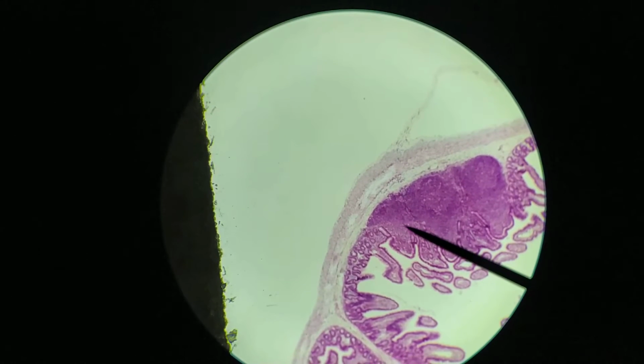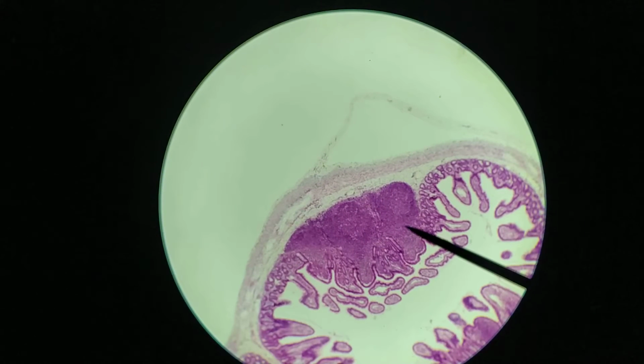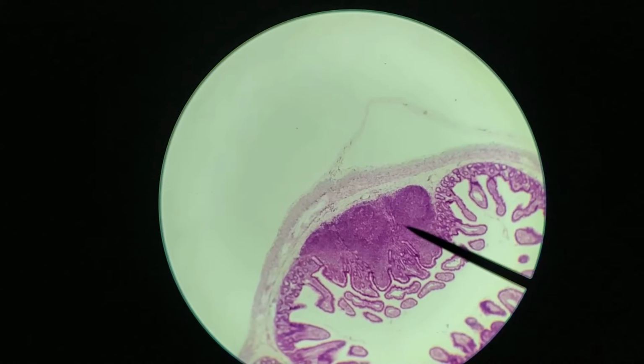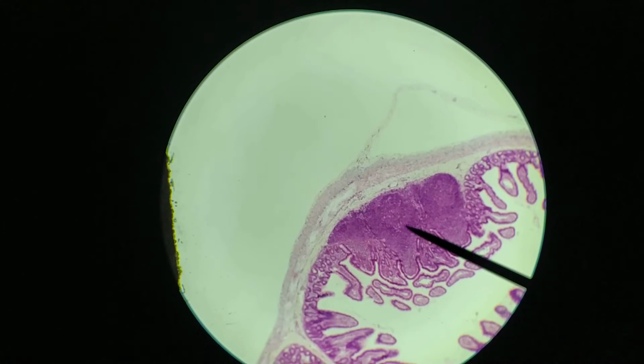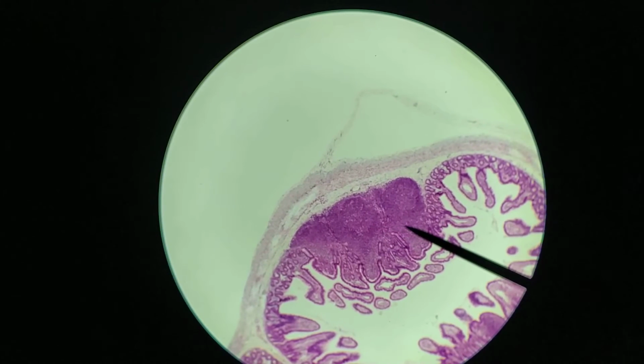And the reason that it's got a specific name to it is that if I were to take this ileum and cut it 5 centimeters further, and you get a section from 5 centimeters away from here, in either direction, I would still see lymphatic nodules in the exact same place in that section. Okay? Basically, what you have is a long chain of lymphatic nodules along the length of the ileum, and so they're not really randomly scattered anymore like they would be in the rest of the body. What you have is a fairly organized structure where they're always in the same place. That's why they're given their own special name. Okay, so this is a Peyer's patch.